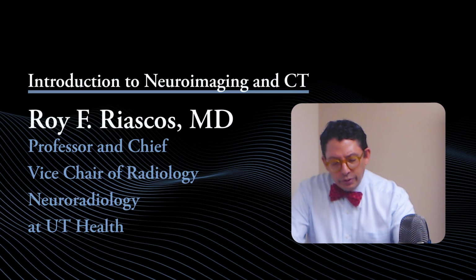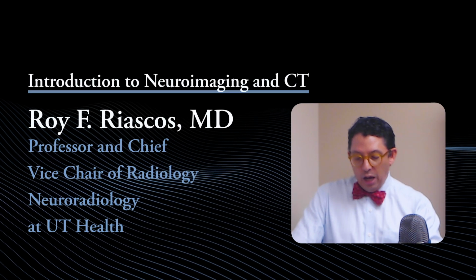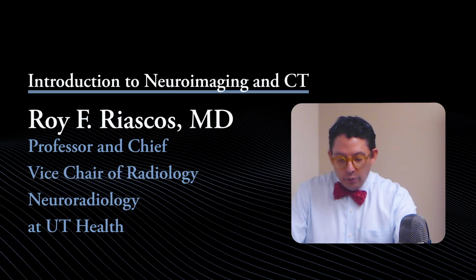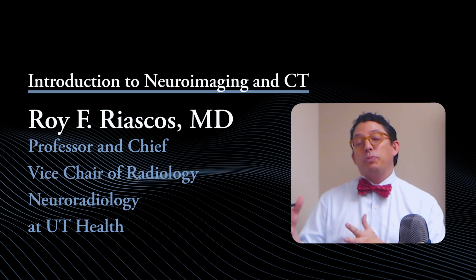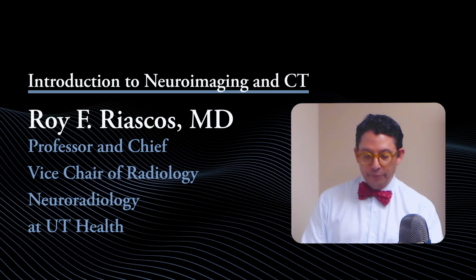When we say level, we're saying the Hounsfield units of all the numbers within the window width that we have. We're talking about width. It's all the tissues of interest that are displayed, and you can change the contrast between them. And we're going to see a little bit about that later in this lecture.